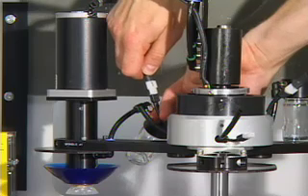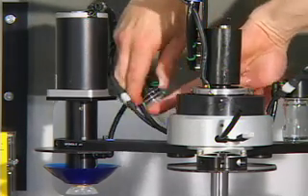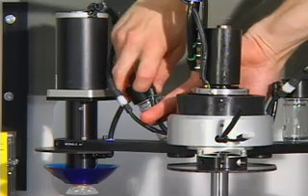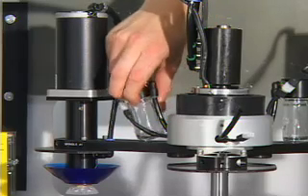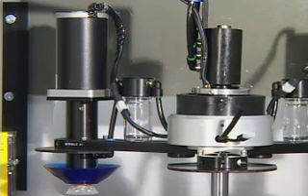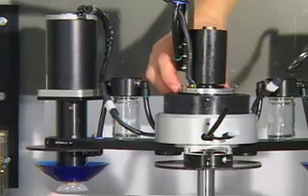Reconnect spindle motor cords and vacuum lines. Zip tie the brush block cord to vacuum lines, making sure that the cord is not able to rotate with the assembly.